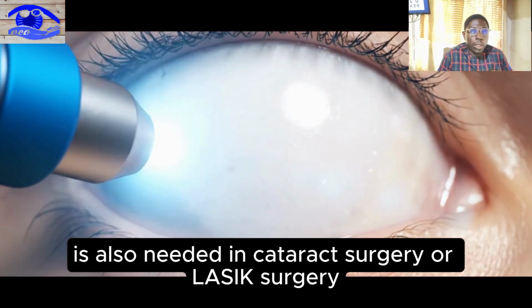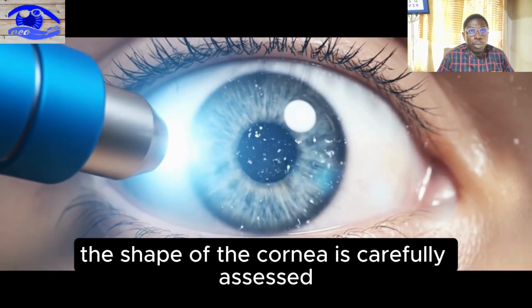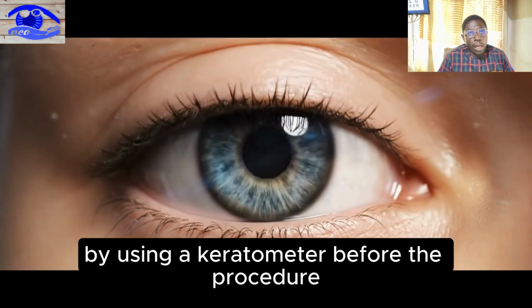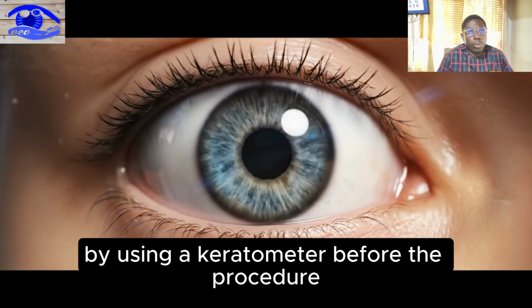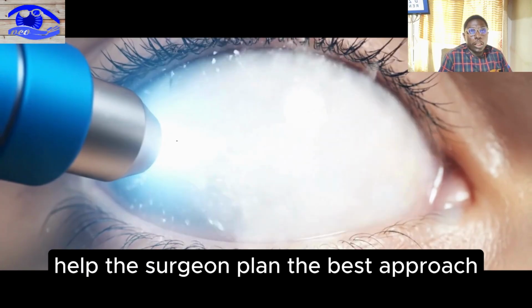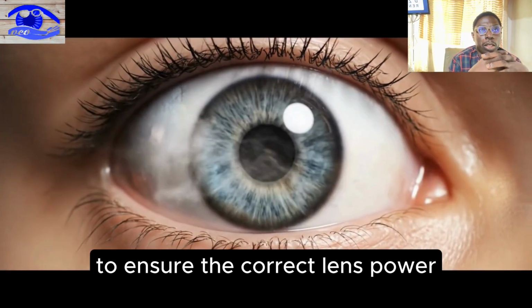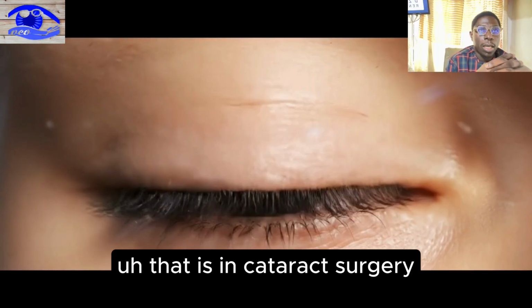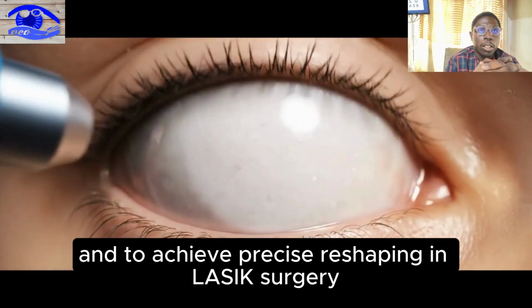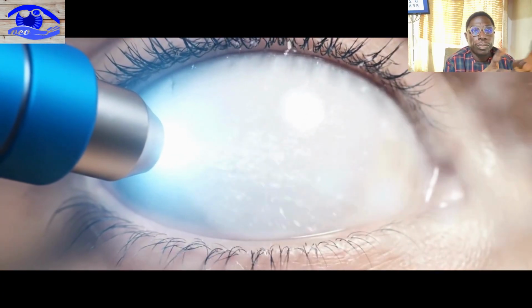Keratometry is also needed in cataract surgery or LASIK surgery. The shape of the cornea is carefully assessed using the keratometer before the procedure. Accurate corneal measurements help the surgeon plan the best approach to ensure the correct lens power in cataract surgery and to achieve precise reshaping in LASIK surgery for optimal vision correction.